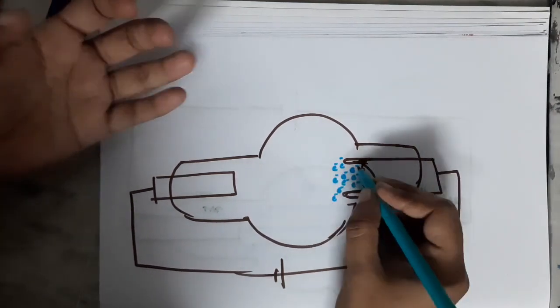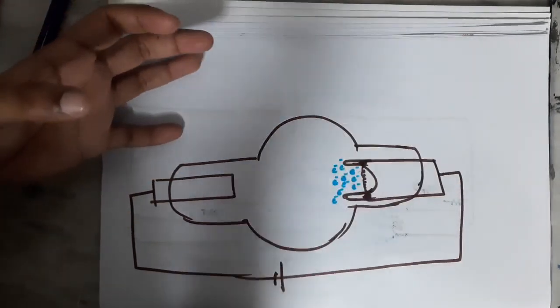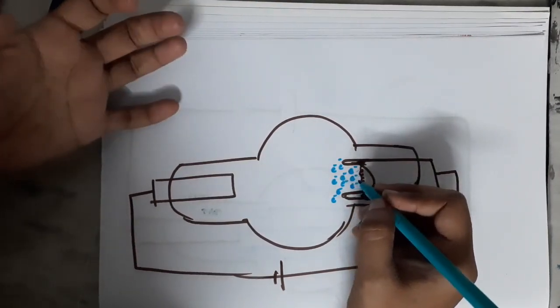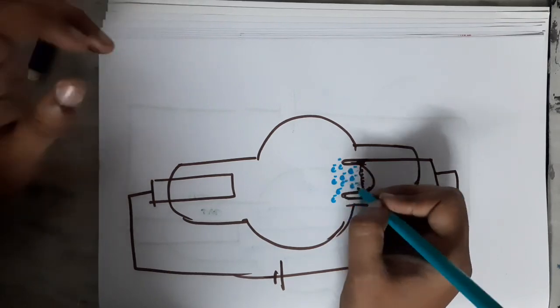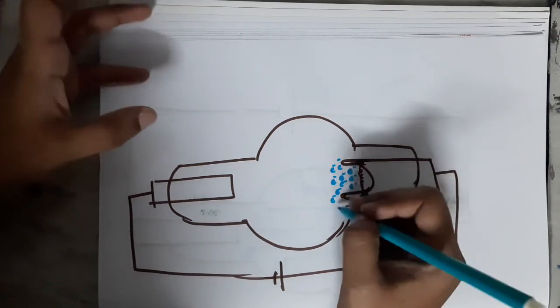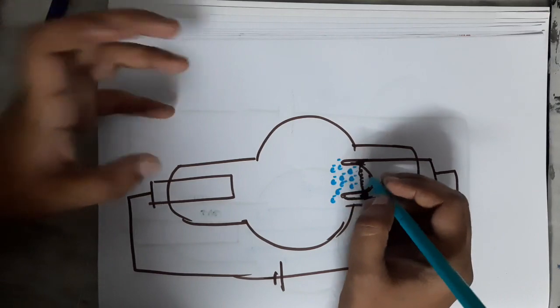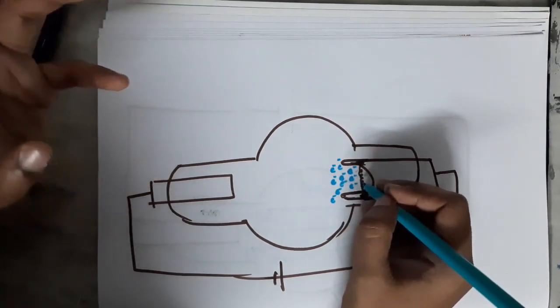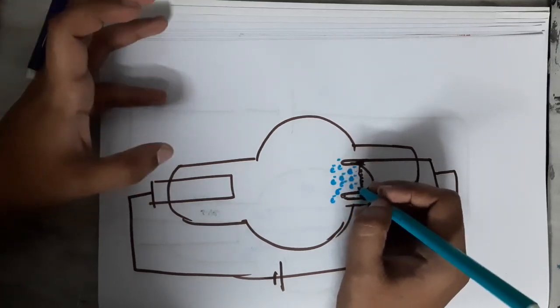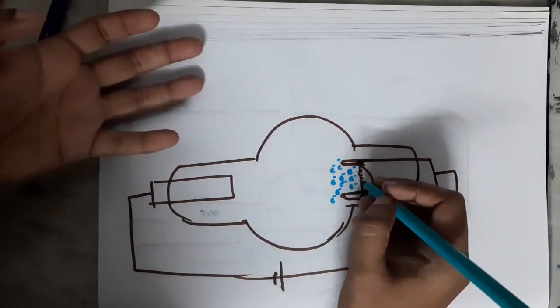This thermionic effect will result in the production of negatively charged electrons around the filament, and this electron cloud is called Edison's effect. Now this collection of negatively charged electrons is called the space charge. This negatively charged cloud will prevent more electrons from being emitted from the filament, and that is called the space charge effect.